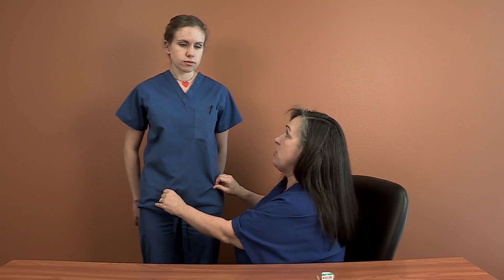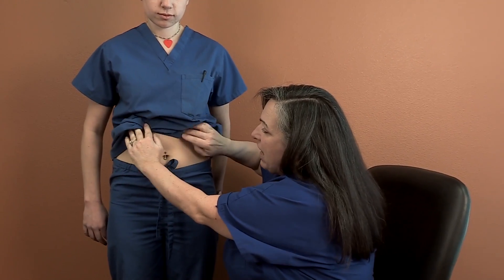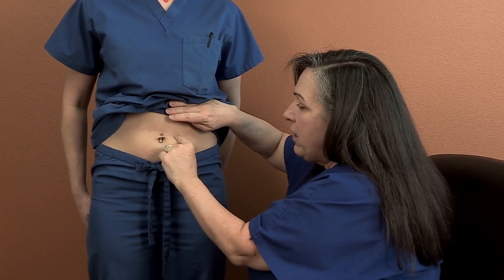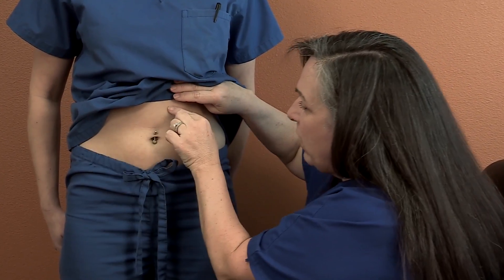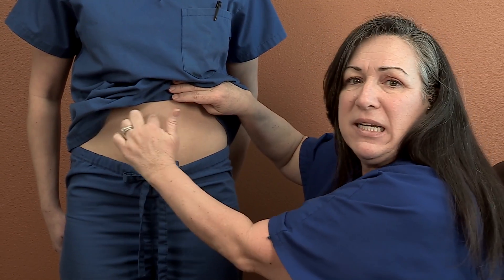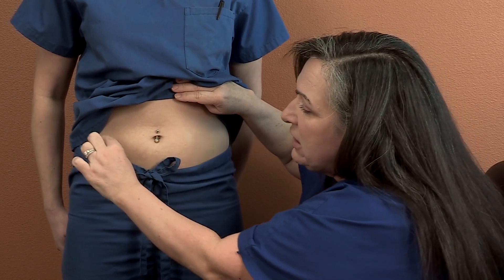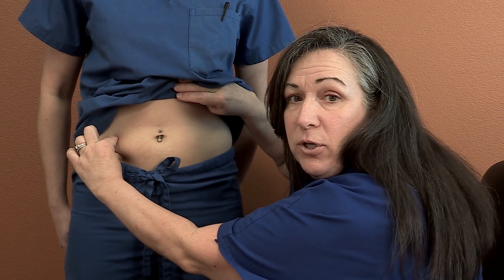One, they're done anywhere in the tummy. Chelsea, if I can just show here — anywhere where you can pinch up a little bit of fat on the tummy. Over here, over here, or up here. Stay at least an inch away from the belly button — it gets kind of tender in there. But you can see all I'm looking to do is just pinch up a little bit of fat.